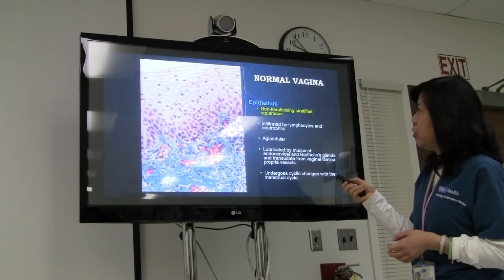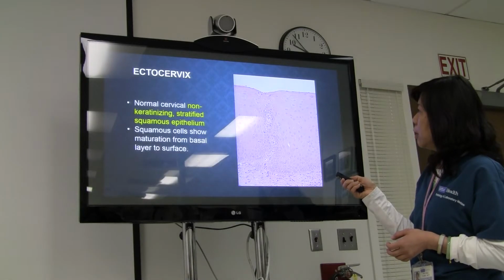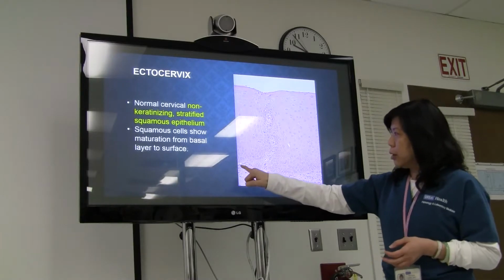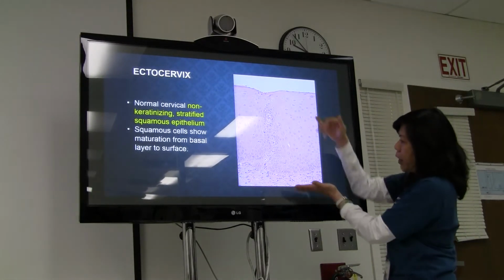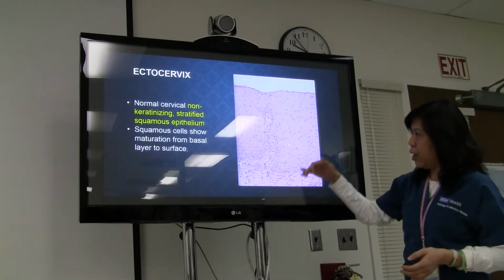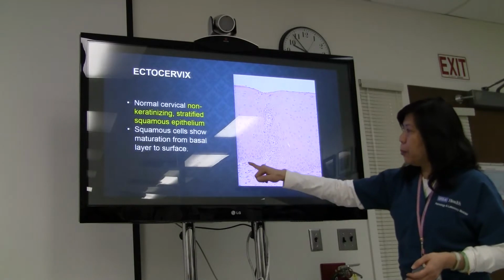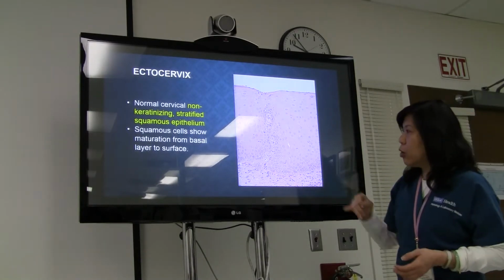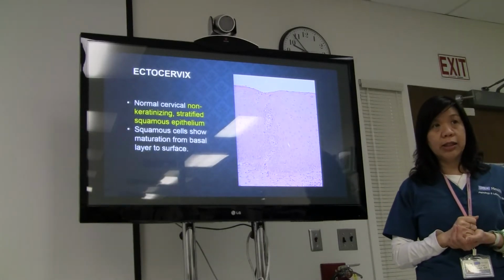In real tissue, let's look at this close up. The very bottom layer, the surface epithelium layer, and the submucosa layer are two different types of cells. The basement layer here has cells we call basal cells, or in other words, reserve cells.